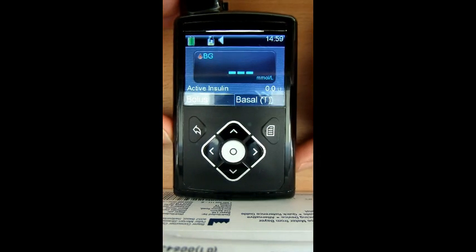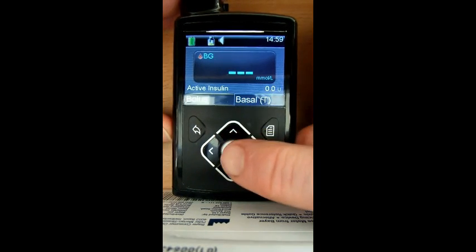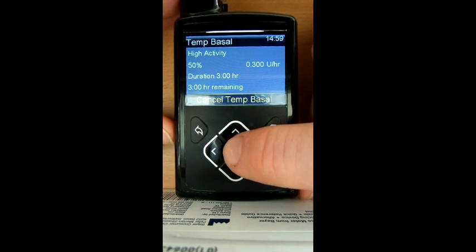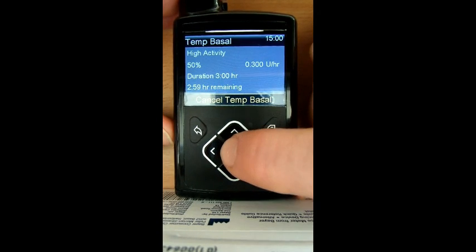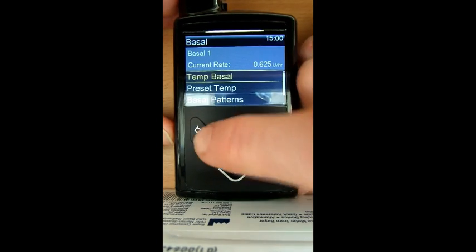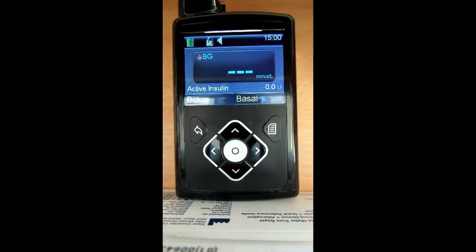That's different now — you can see next to the basal you've got a 'T'. It tells you the temporary basal is running. Before on the Veo we just had an open circle, and that could have been a dual wave, a square wave, or a low battery warning. So now you know the temporary basal is on. Let's see how easy it is to get rid of that — cancel temp basal, tells you how long is remaining, cancel it off. T's gone — perfect, pretty useful.